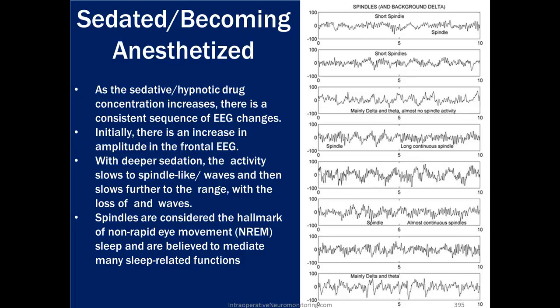Spindles are considered the hallmark of non-rapid eye movement sleep and are believed to mediate many sleep-related functions. So when you see a spindle, as shown in the very top picture here, we have spindles here, and then we have some more spindles here. This is that non-rapid eye movement state of sleep.